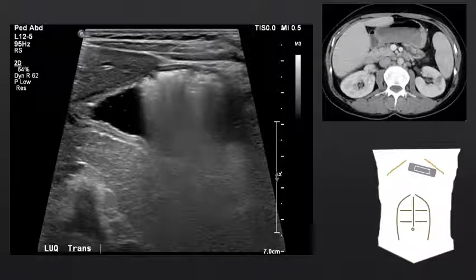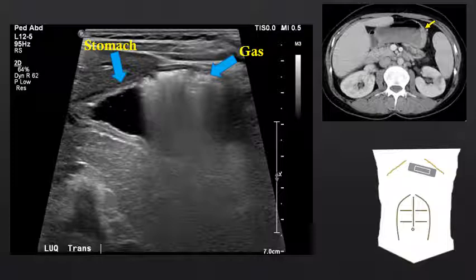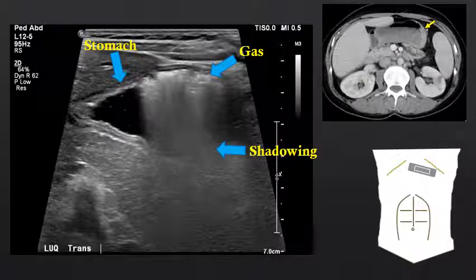Looking at the stomach in a transverse orientation, we can again see the complex three-layered wall of the stomach. In this case, the stomach is filled with both gas and fluid, resulting in two characteristic artifacts that we can see from bowel. The gas does not allow for good penetration of the sound waves, and therefore deep to gas-filled structures we will have shadowing.